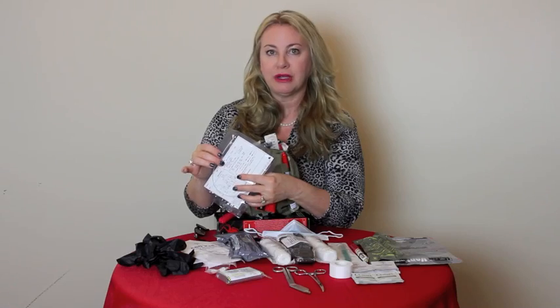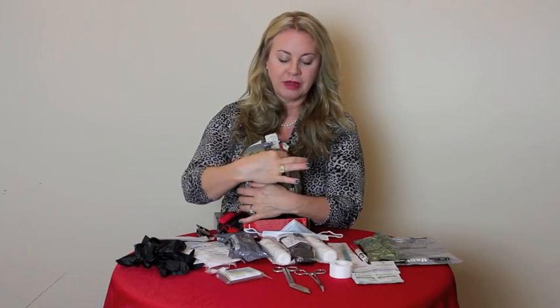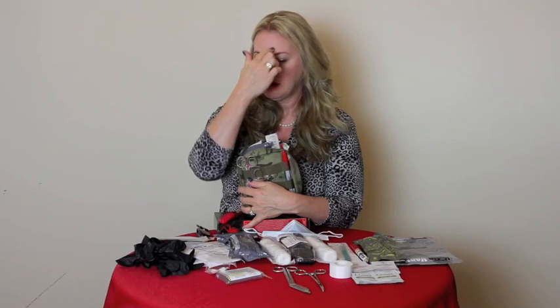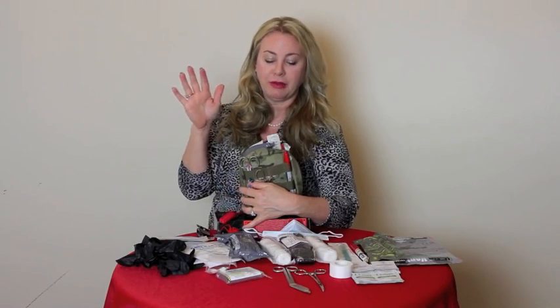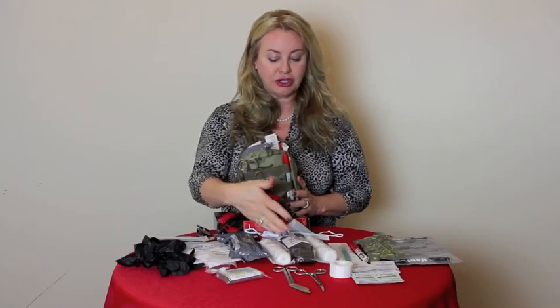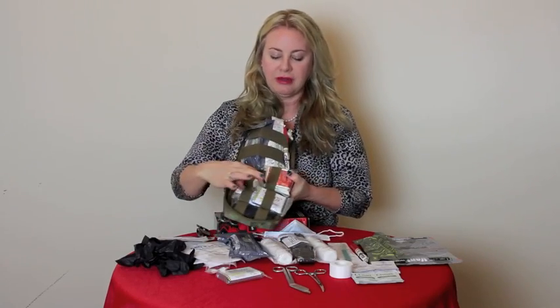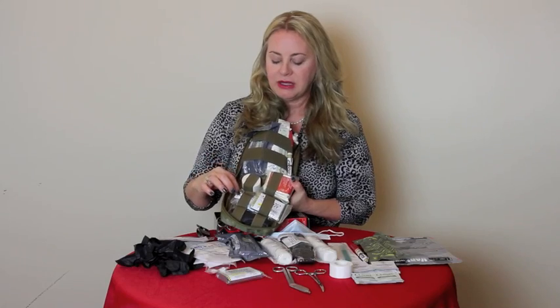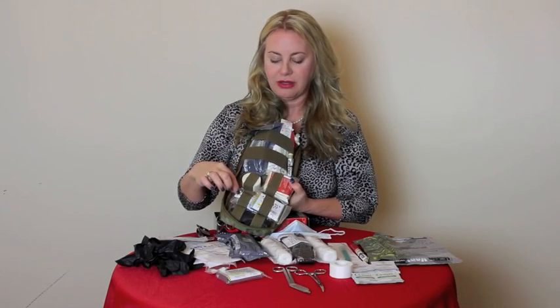If for some reason you don't have time to use this and you are using the tourniquet, go ahead and take the red marker, put a T right there on the forehead. This is going to alert people that you have applied a tourniquet. So we'll get to that part in a second. Underneath the Mylar blanket and the ammonia inhalants was the mask. It is sitting underneath there.